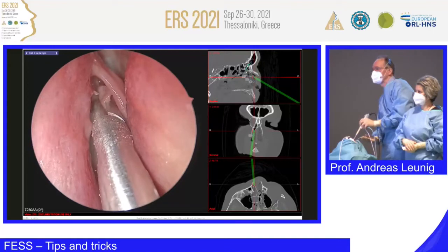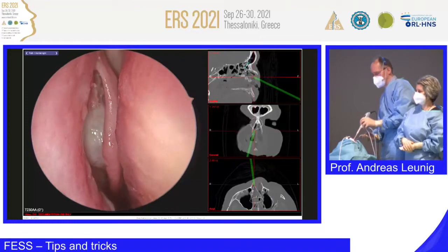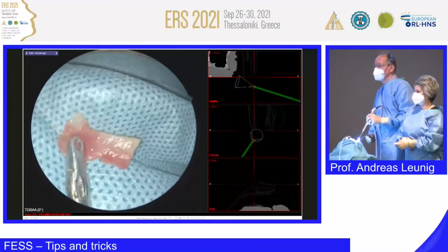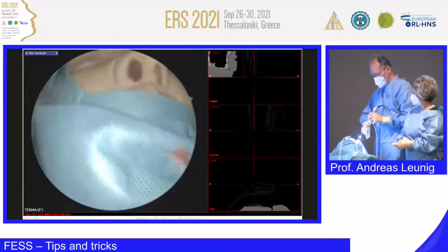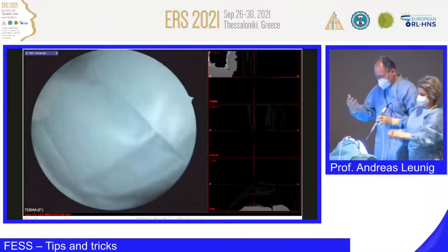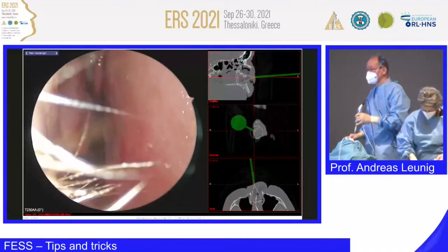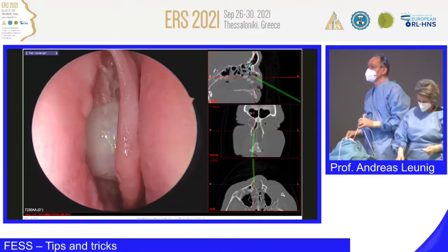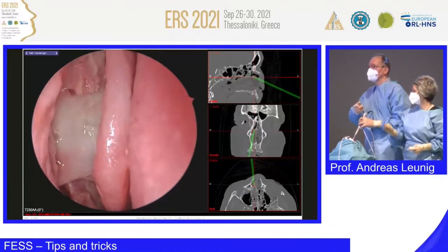Now, I take the uncinate process with a Blakesley. I am not tearing. Now we have a look. And this is a specimen. Yeah? It's a tiny bony lamella covered by mucosa on both sides. And sometimes you have some polyps arising from this structure, and so it makes sense to open here to get more access to the inflammatory process, whatever you have to deal with. So now, Kuhn spoon, please.